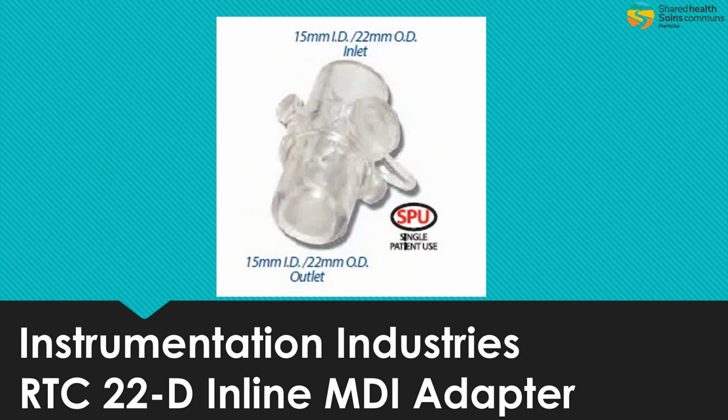Hello and welcome to this video on how to use the new RTC 22D inline MDI adapters. These adapters are to be used in conjunction with medication profile M15 salbutamol. Whenever we need to ventilate a patient using a BVM, or a patient that has an iGel, we are to use this device to administer salbutamol.